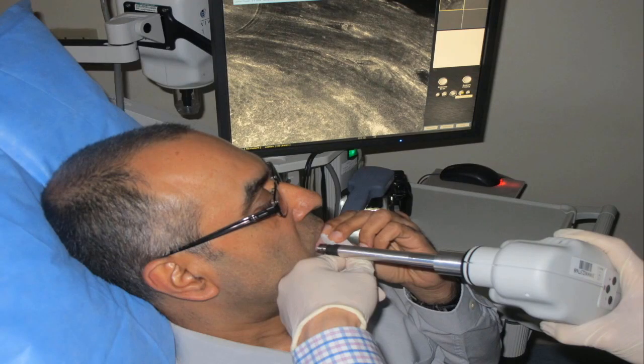And then this is Milan. I have to show a photo of him because he's the inventor of many of these tools. So this is an oral probe, for oral dysplasia and squamous cell carcinoma. So again, the idea is that with these non-keratinized structures, we can see maybe even a little deeper because we're not blocked by the stratum corneum.